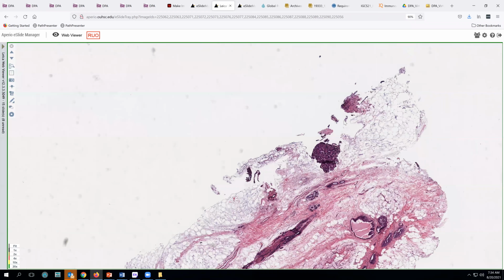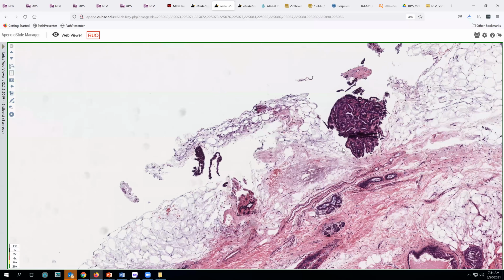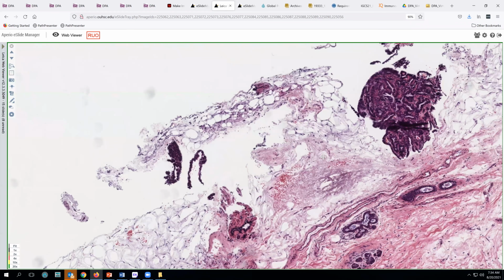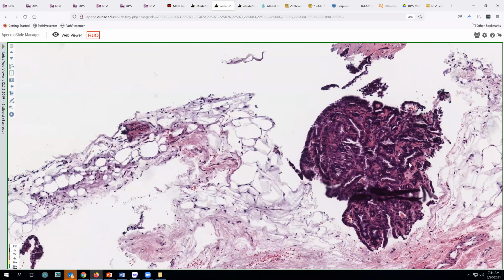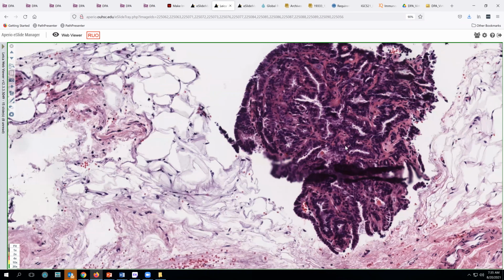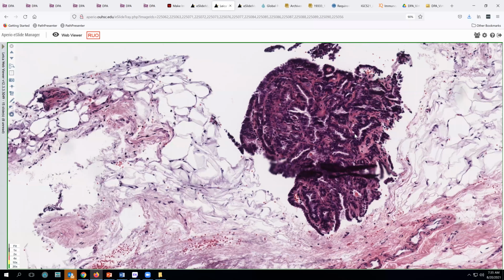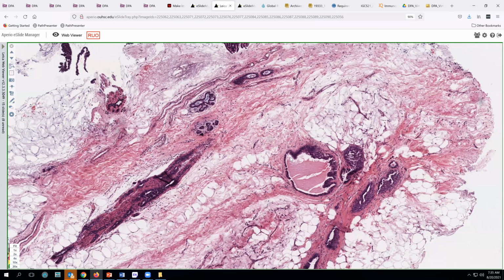Now, we also, however, have here this little fragment out here. And as you can see, this is not really attached to the tissue, but it has a papillary pattern of architecture, some sclerosis in between, and these lining epithelial cells around the edges of this fragment. This appearance of a fragment like this sort of floating along with the tissue is a strong suggestion that there's some sort of an intraductal papilloma type of lesion in this patient. We're not seeing the duct per se. This might have been related to it, but again, it's not clear that that's the case.